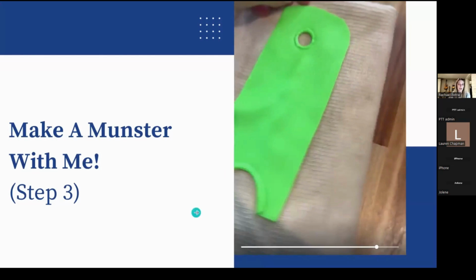So if you're just starting out, I would recommend doing it this way. So go ahead right after you get it out of the water, roll your thumb hole and roll your elbow crease, or whatever splint that you're making that you're going to make a hole for or a cutout, go ahead and roll it. That way it'll save you time later when you actually go to make your fabrication.